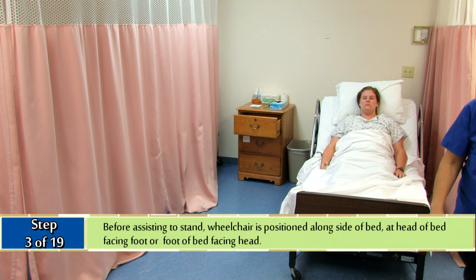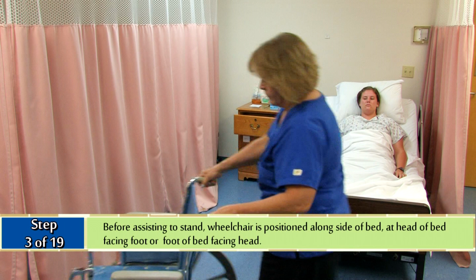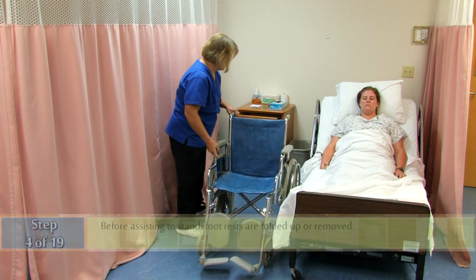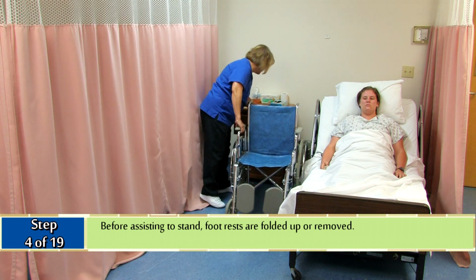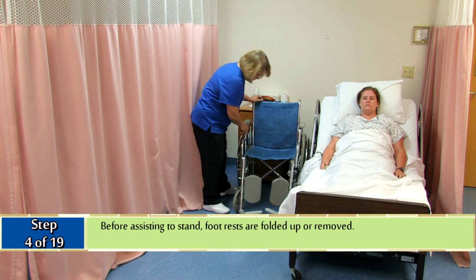Before assisting the client to stand, the wheelchair is positioned alongside of the bed, at the head of the bed facing the foot, or at the foot of the bed facing the head. Before assisting to stand, footrests are folded up or removed.